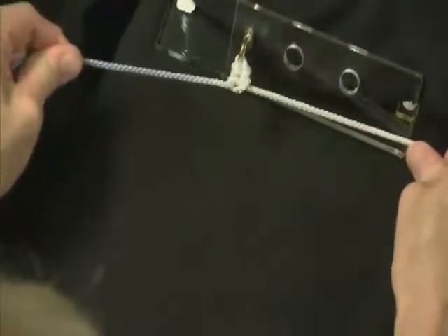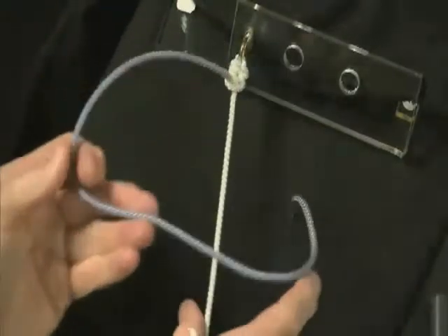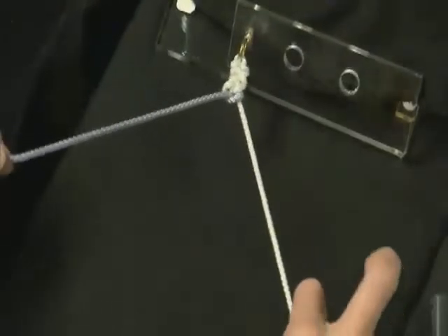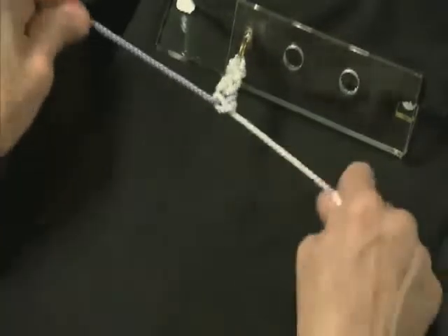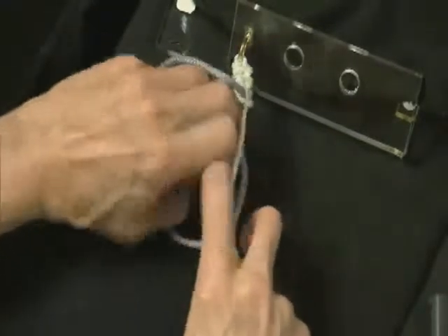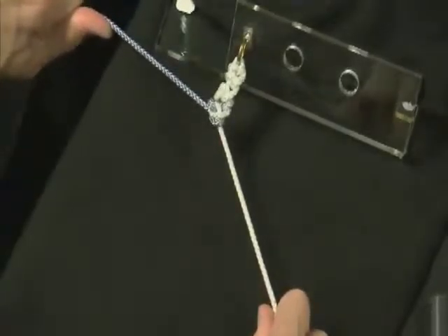Then we'll do reverse half hitches on alternating posts. We'll go over — this is our wrapping limb. We'll go over, then come under, switching our post back. And then come over. And now we have a secure knot.